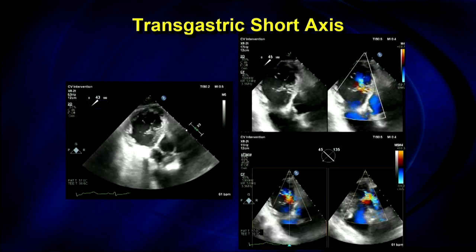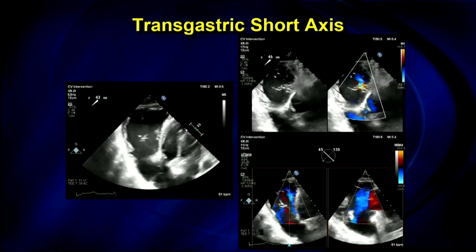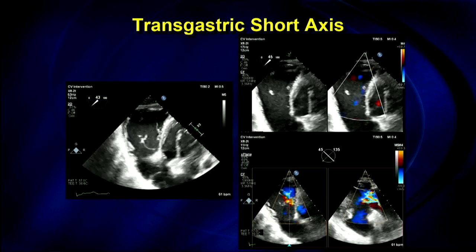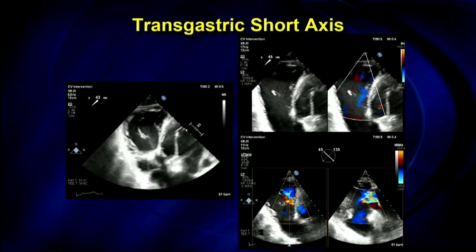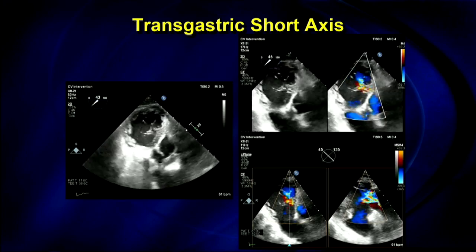But here again, from the transgastric short axis view, you pick up that there's this cleft in the anterior leaflet that you might not have seen from the 3D, and that the regurgitation is kind of around that area of cleft and going more posteriorly.